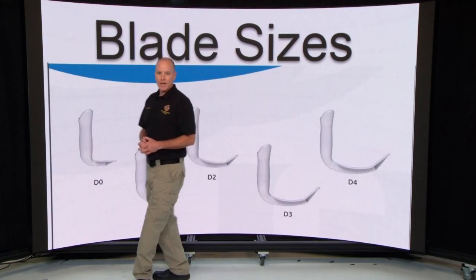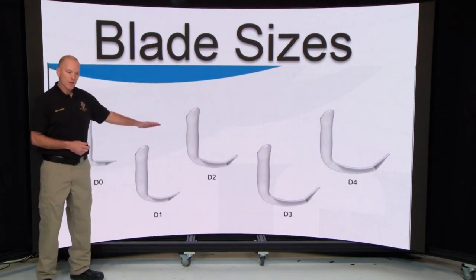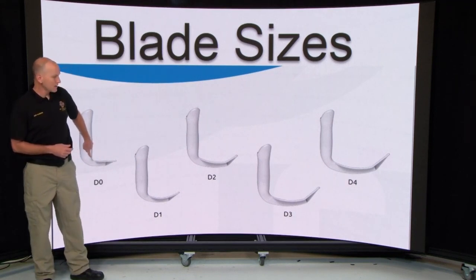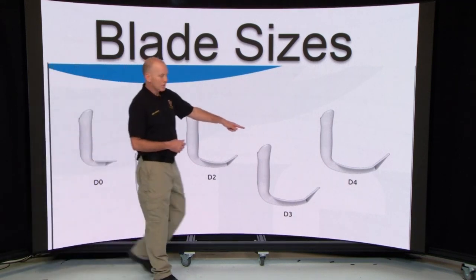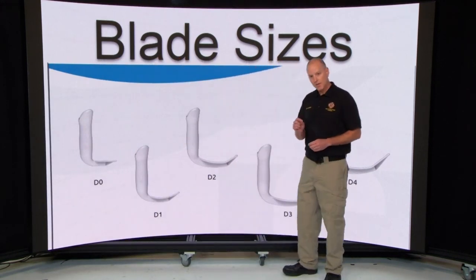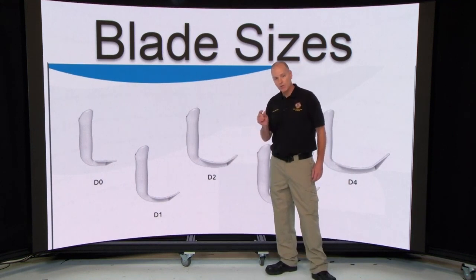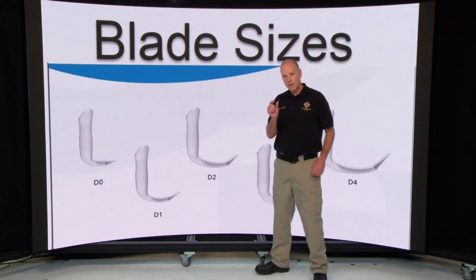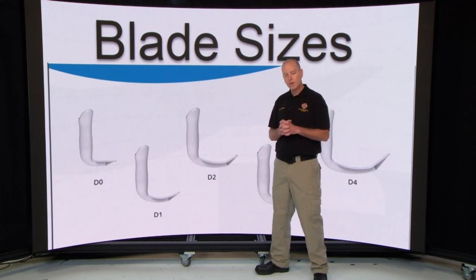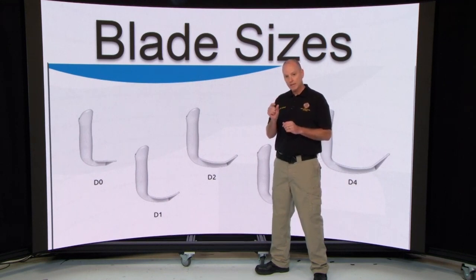As you can see right here on the UEscopes, we're going to end up carrying all 5 blades. We're going to have blades from the neonates all the way up to your very obese and giraffe patients. The unique thing about these blades is they're hyperangulated, and I'll show you a blade close up in a second. It's about as narrow, for those old school medics in here, as when we used to manually intubate with the Miller and Macintoshes. It's as wide as the old Miller blades.